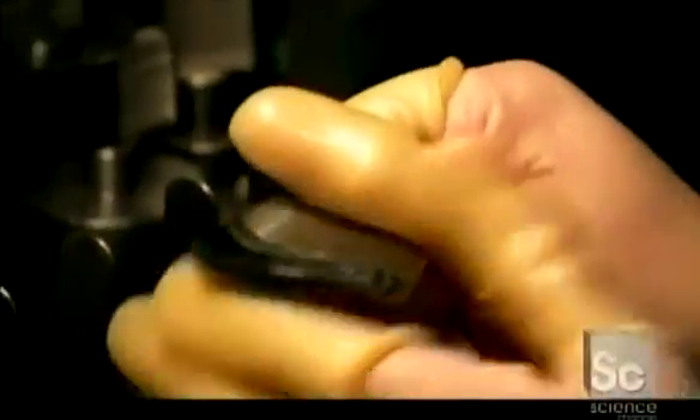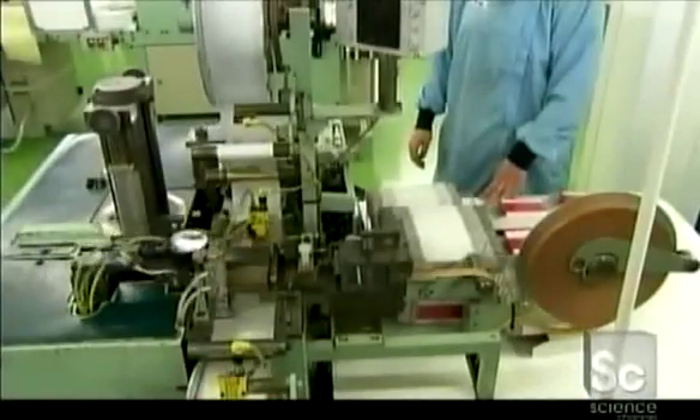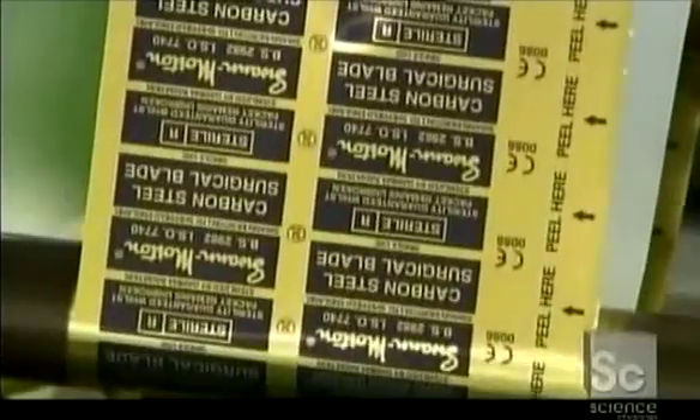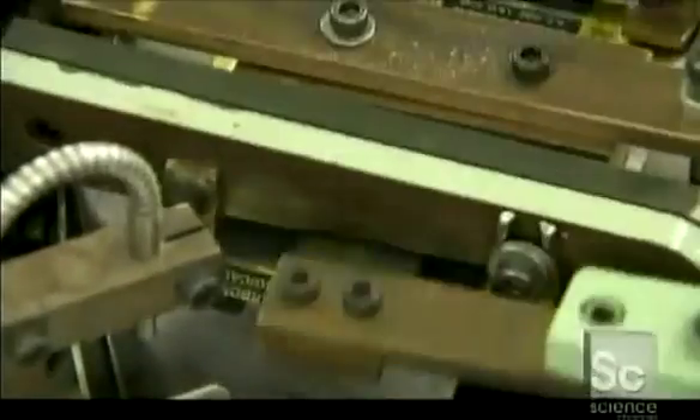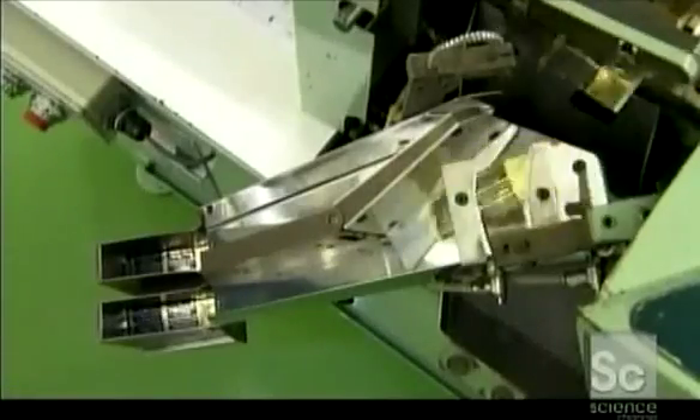Each and every blade passes through two different inspectors. In the packaging department, a machine covers each blade with a brown paper strip that contains an anti-corrosion chemical, providing extra protection against rust. A second machine slips each blade into a foil packet, then cuts the packets apart. Each packet bears the blade model number and tracking code.